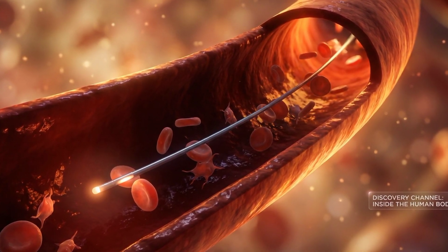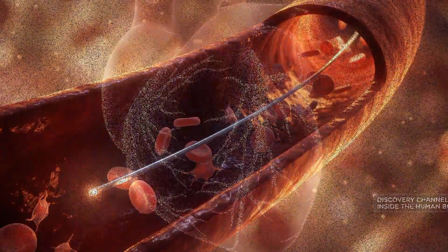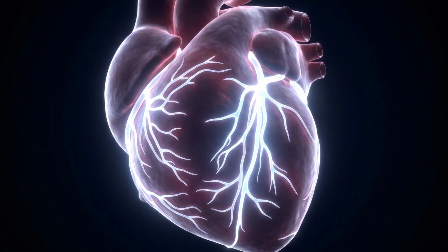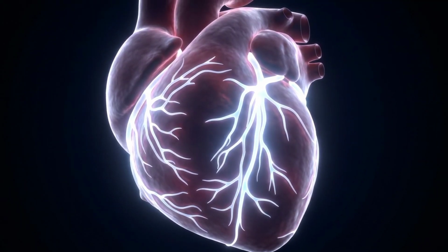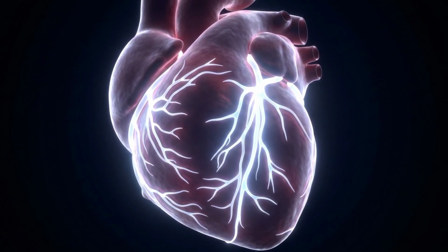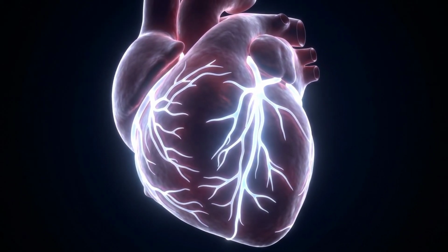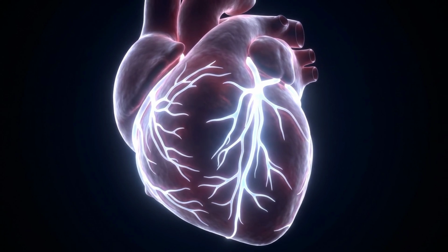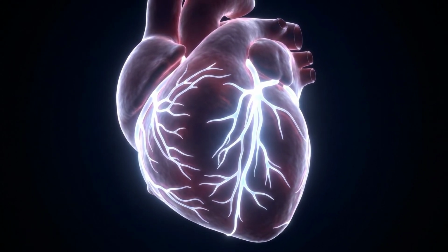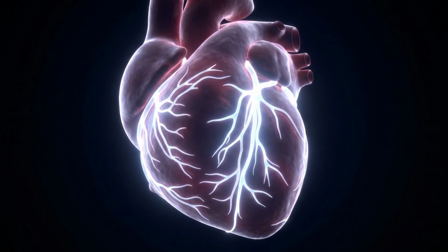If they find a block, they insert a catheter with a balloon, which is positioned at the area of the blockage and then inflated. If they inflate, what will happen? This opens the narrowed artery. The artery would be narrow, and by this time, the narrowed artery will open up.